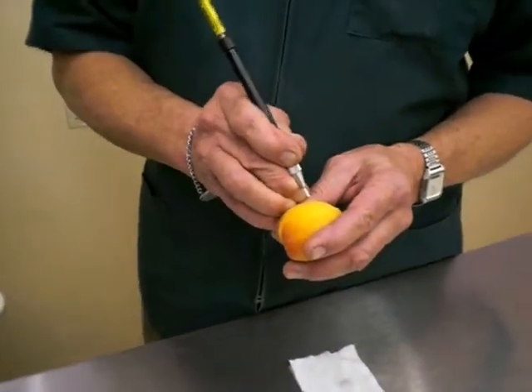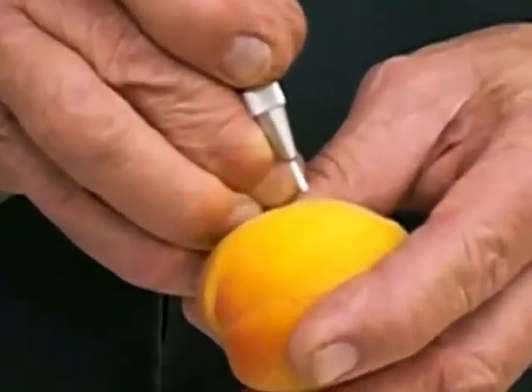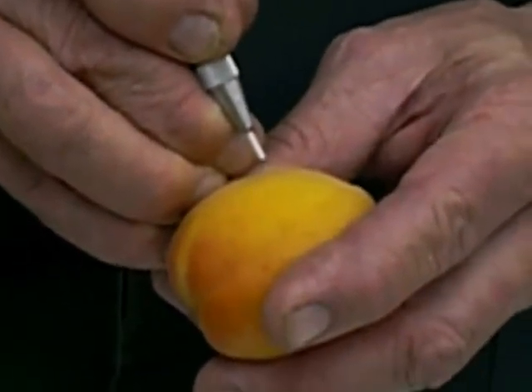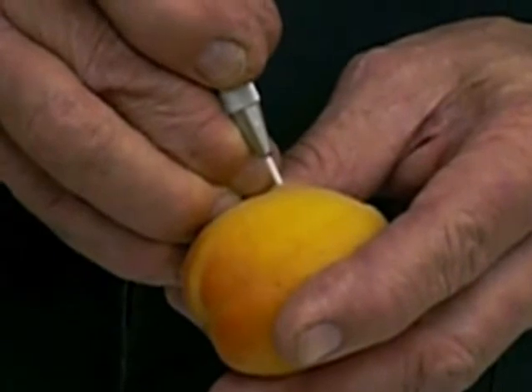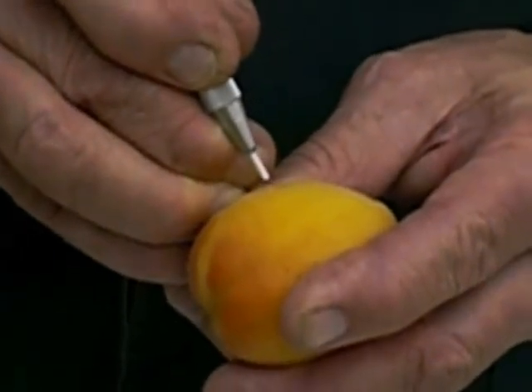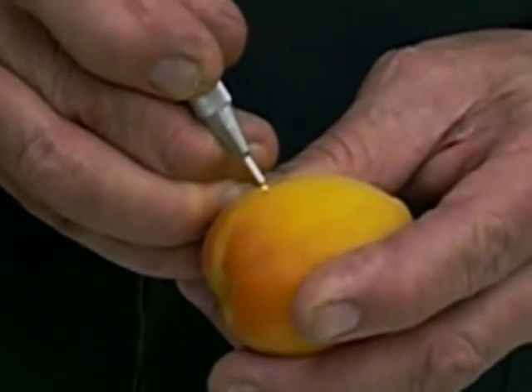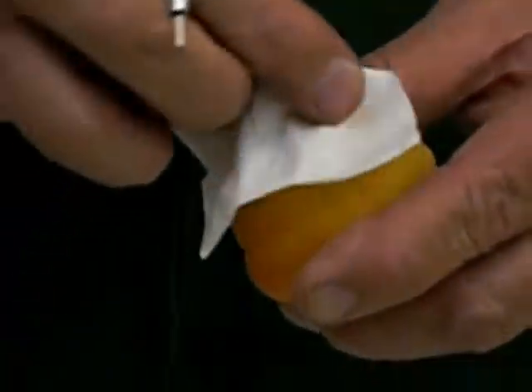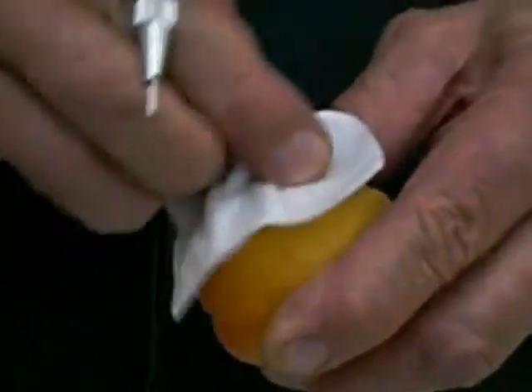This is a wave guide with a laser tip, and by depressing the pedal the laser energy comes all the way through this laser wave guide and out the tip. I can just go along this apricot and that shows you what an incision would look like. There's a little bit of charring but we always wipe that away with a damp sponge.